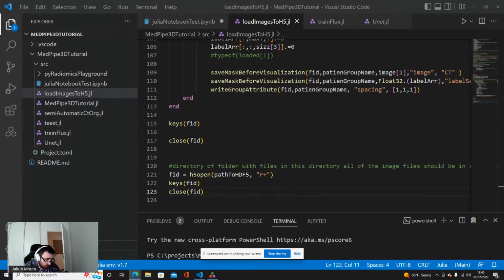Basically, the repositories are work in practice. I would like also to port ITK to pure Julia. Yes, because ITK is written in C++. SimpleITK, which we are using here to load the data, could in principle be taken from C++ into BinaryBuilder, and those problems that happened today should be avoided if all of this would be ported to pure Julia, instead of passing it from the C++ for the data loading.